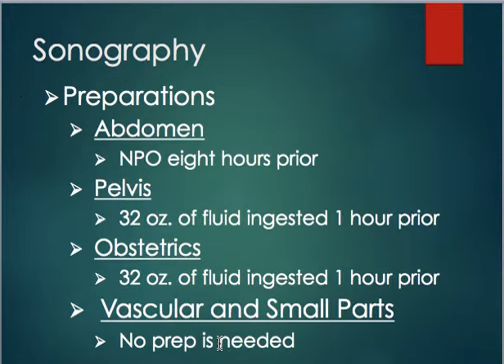Now, preparations for some of the different procedures, or different scans, I guess I should say, not really procedures. For an abdomen, the prep is NPO for 8 hours prior. So nothing per mouth for 8 hours prior to the scan. We want to make sure that the GI tract is empty when we're looking at the abdomen, and it also helps distend the biliary tract. So we want to make sure that there's no food in there, that it's not causing the gallbladder to contract from eating previously, and things like that.